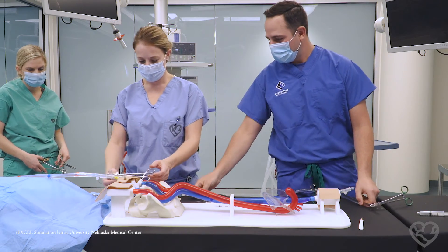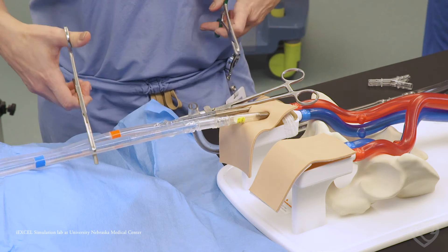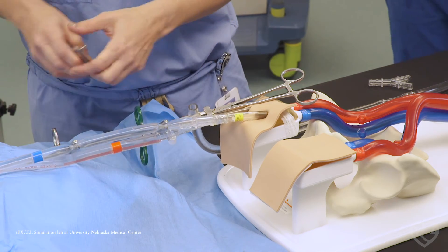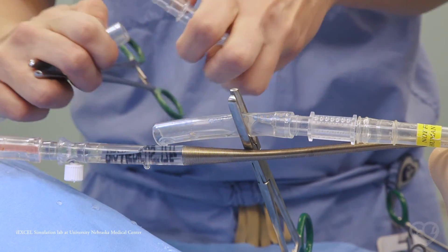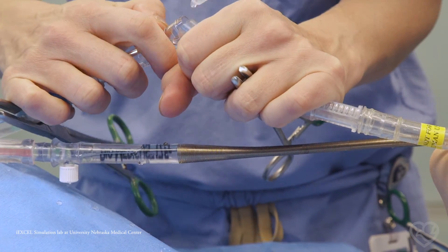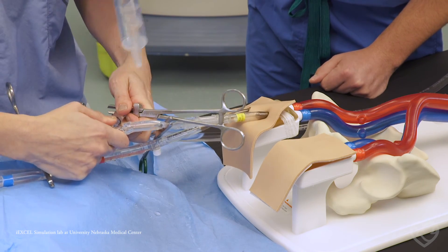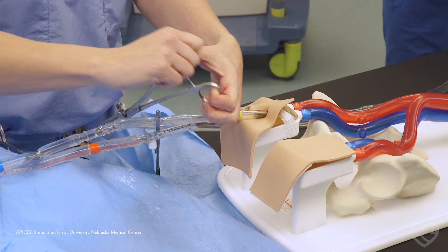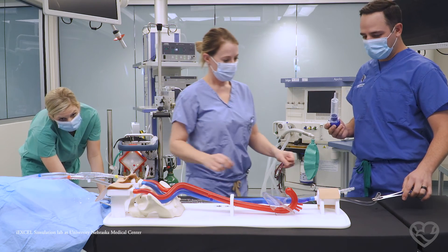The tubing which will be spliced into the circuit may be prefilled with fluid to decrease this period of separation. The tubing is measured and brought up to the field. At this point, communication with the team is critical as flows will be decreased and then temporarily stopped. Two tubing clamps will be applied to the venous line and the tubing will be cut. Then the Y connector will be added to the tubing after appropriate de-airing. The additional tubing will also be added to the circuit but will remain clamped. Flows can now be re-established through the circuit while the additional line is brought up towards the head, de-aired, connected to the IJ cannula, and then unclamped as well.